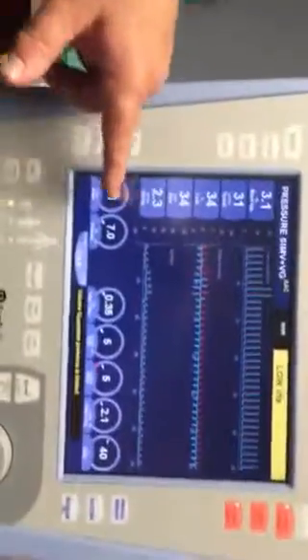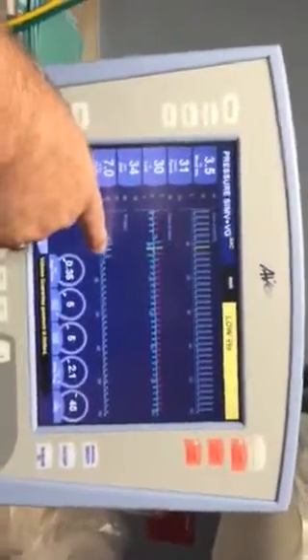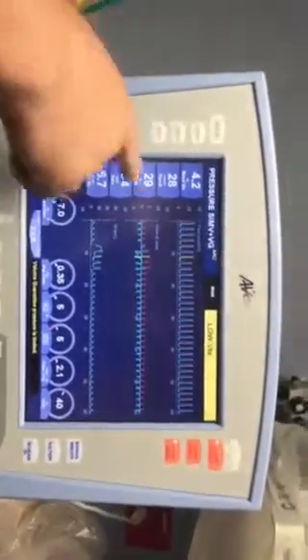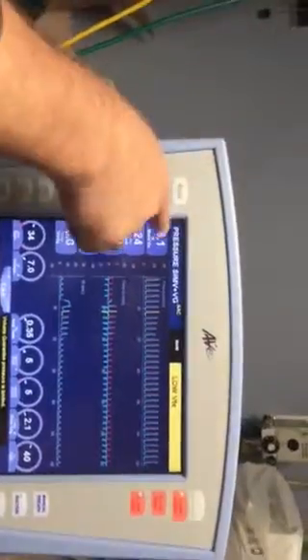If I have my test lung, with my little things on it, watch what happens. Let's do it in reverse. Let's say I've set up my target here, and now I surfactant my baby. Watch my tidal volume. My tidal volume's going really high, so it's going to change my flows until I reach back to 7.